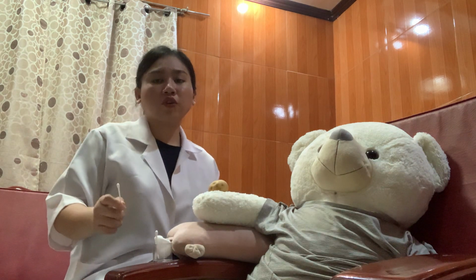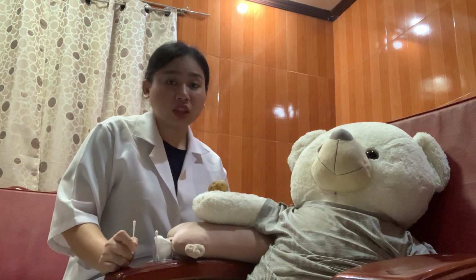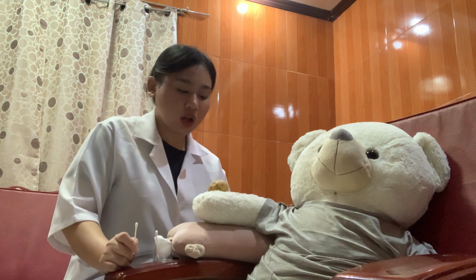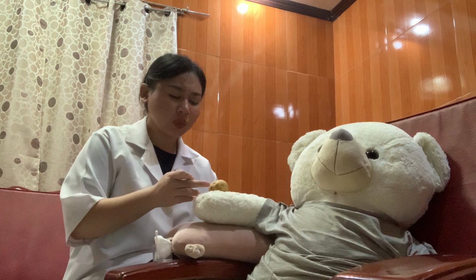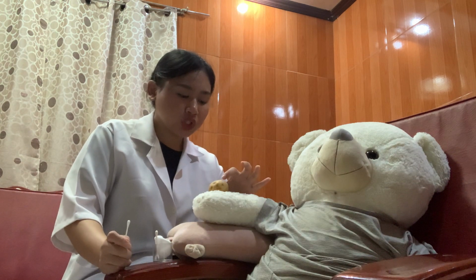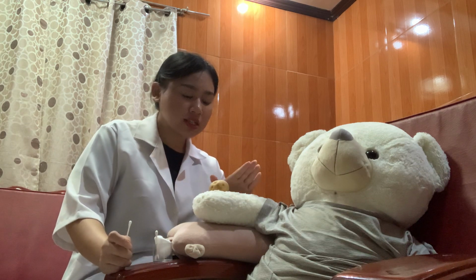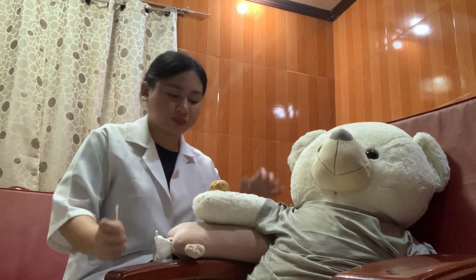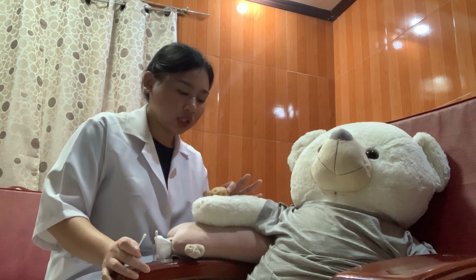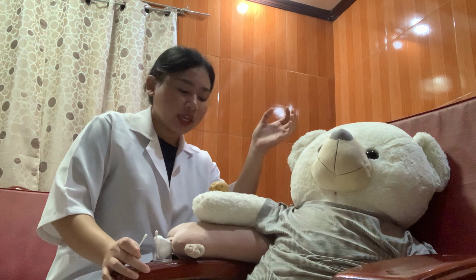The use of povidone iodine will prevent local infection, while the alcohol increases the visibility of the site by cleansing the coloring of the iodine. Then it is very important to dry the alcohol site, because a moist alcohol-prepared site can increase pain.